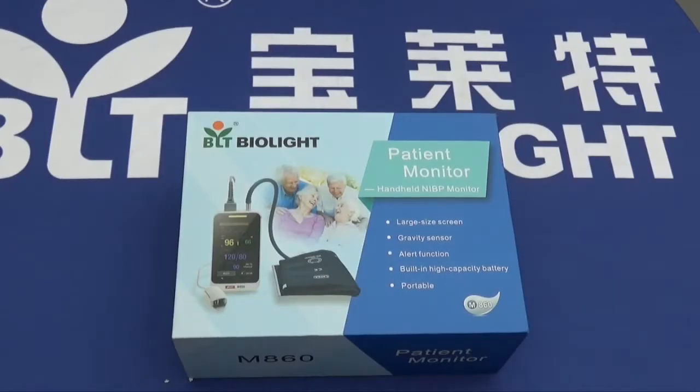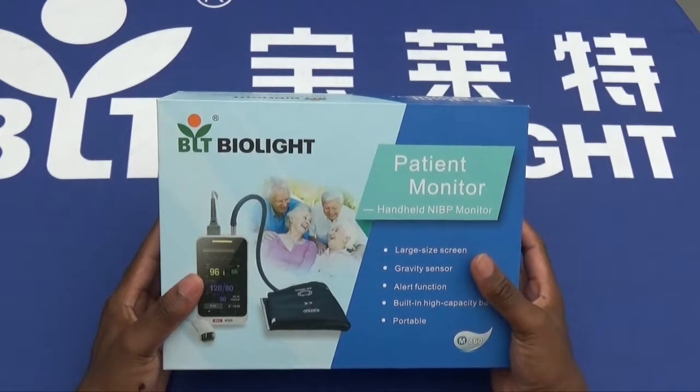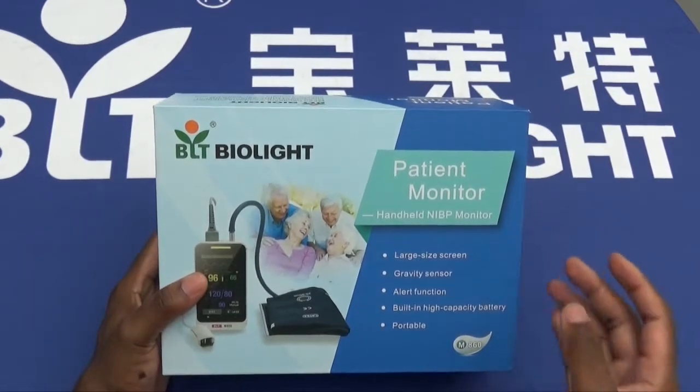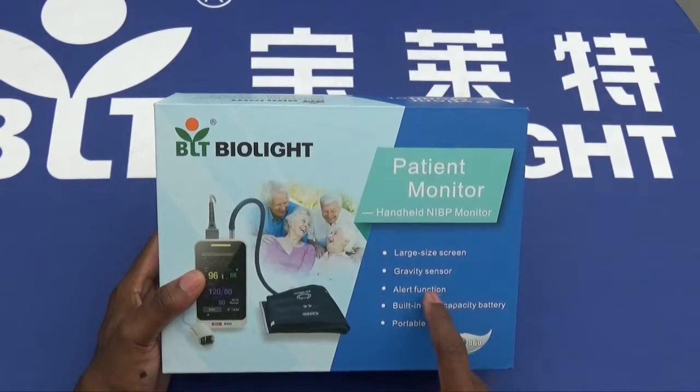Hello and welcome to an unboxing and introduction of Bioline's M860 patient monitor device. Starting at the front of the box, we have some general information regarding what you should expect of the device. This includes a large-sized screen, a gravity sensor, alert function, built-in high-capacity battery, and the device is said to be extremely portable.